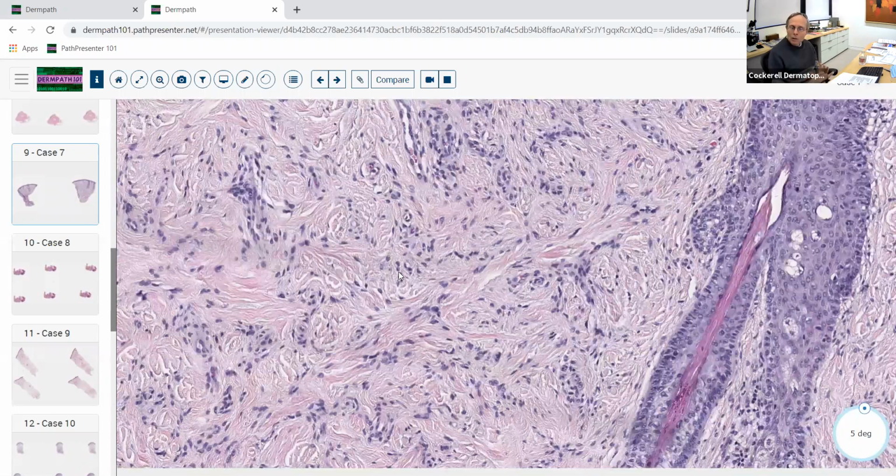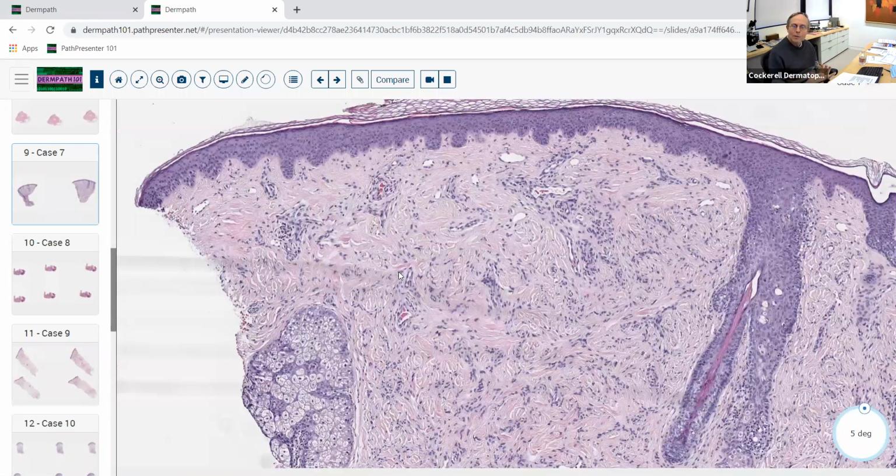If you have a good clinical correlation that goes along with this pattern, these splayed cells diffusely in the dermis, you should be thinking of scleromyxedema. And again, there's the papular mucinosis type, where you get these cells between the collagen bundles with a lot of mucin. There's some types where you get very few cells and you just see tons of mucin.